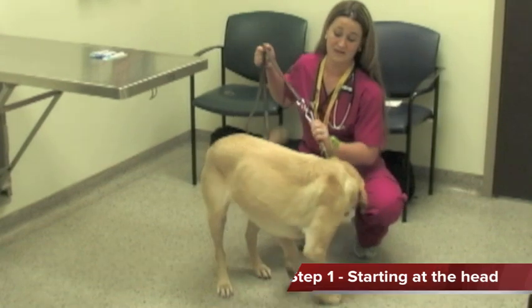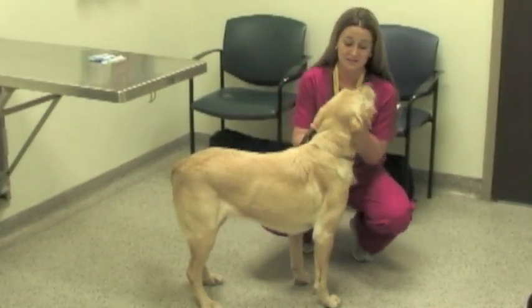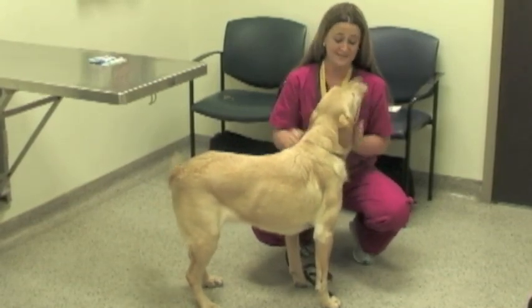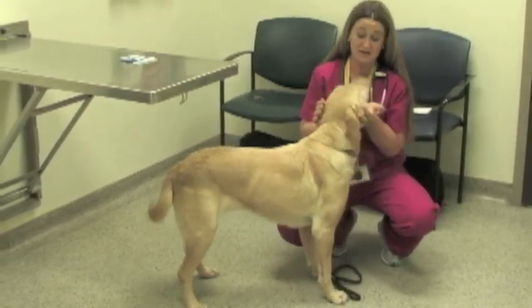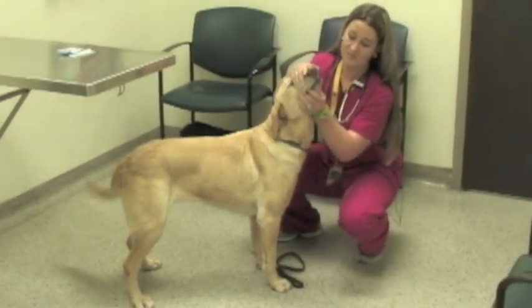The first thing you want to do — I like to get on their level personally — and kind of get to know them. Just let them smell me, know that everything's okay. I like to start from the head and go back. The first thing I start with is looking in their mouth.